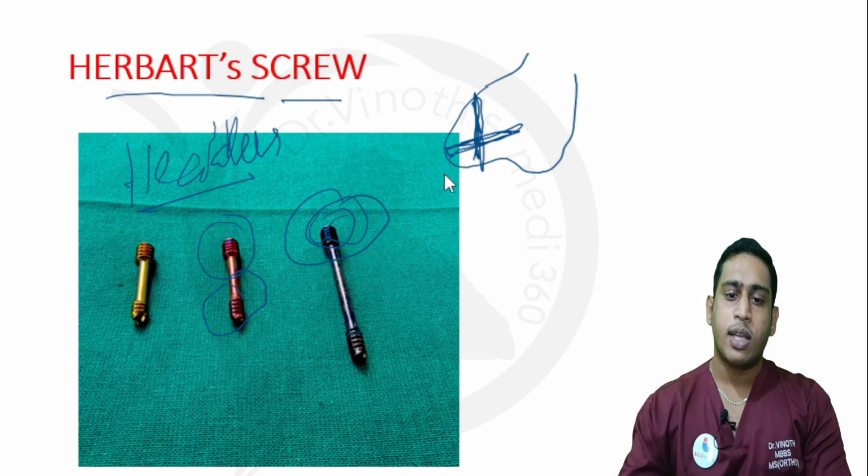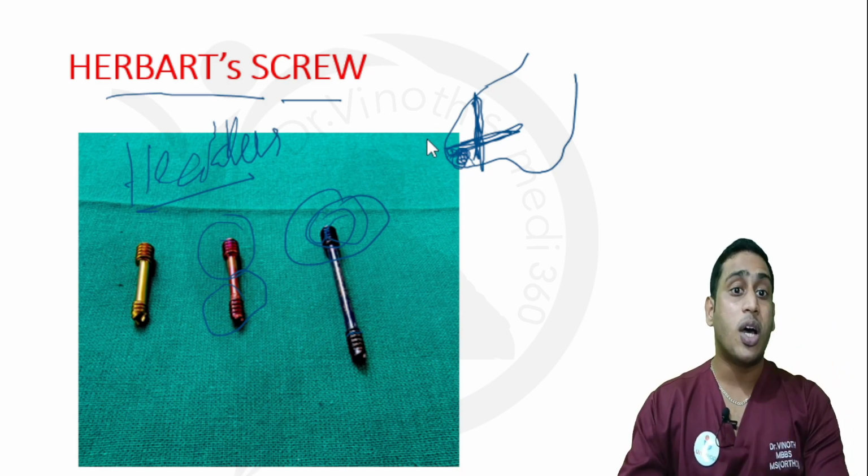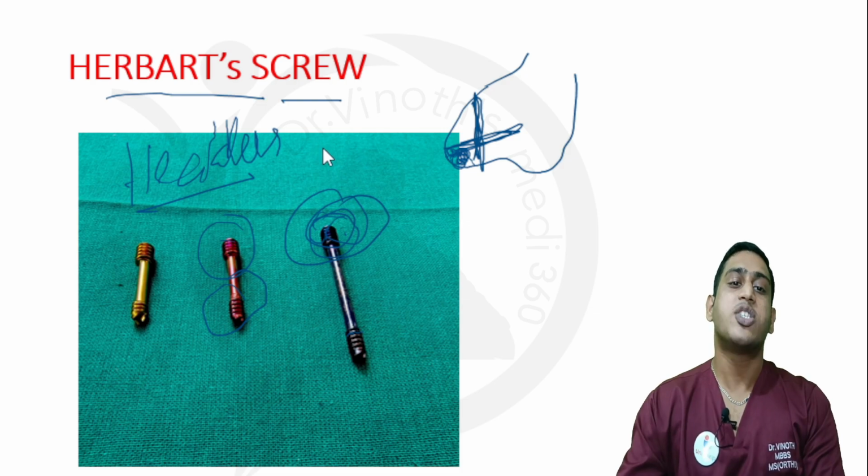And the second thing, this being in the articular surface, assume that the fracture is coming in the articular surface. I don't want any part of the screw to protrude into the articular surface. So I will put a Herbert screw and bury the head part or the proximal part. As I told you, there is no head for this screw. Even this proximal thread will lie within the bone. So these are also called headless screws.